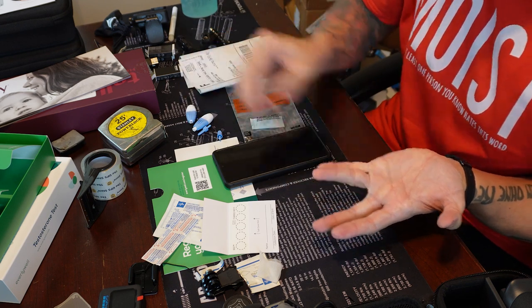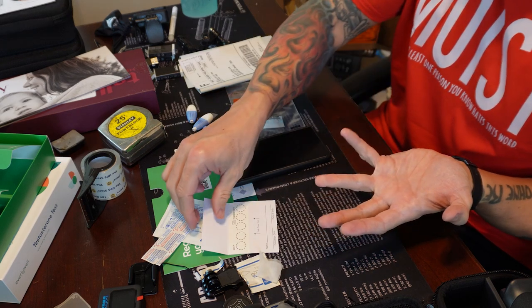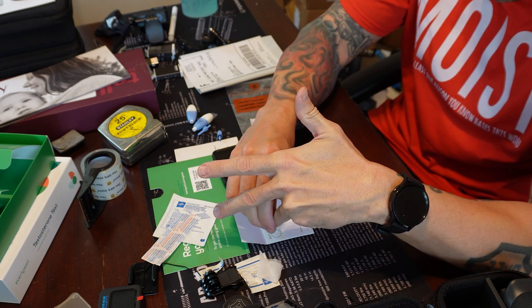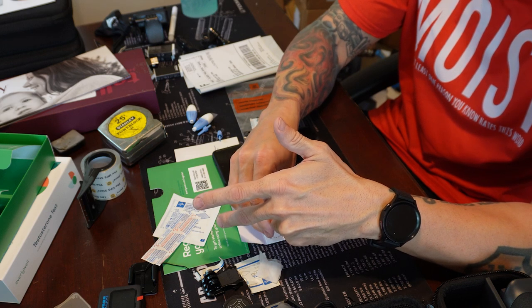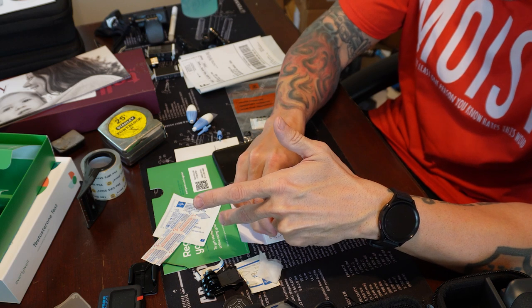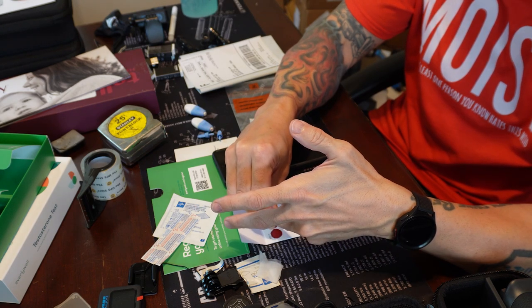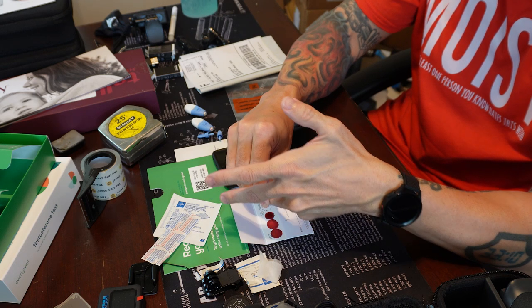You can vaguely see it starting to bleed. It doesn't hurt too bad, but it's a pretty small hole so it doesn't get a lot of blood — that's why this step takes quite a while. I tend to have thick blood anyway. I ended up using both lancets, and now it's bleeding pretty well, so I'll easily be able to fill in the circles.